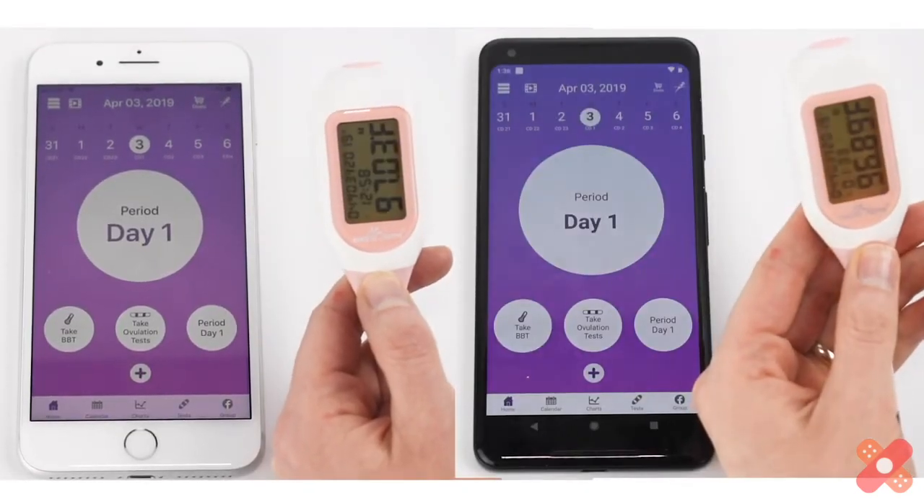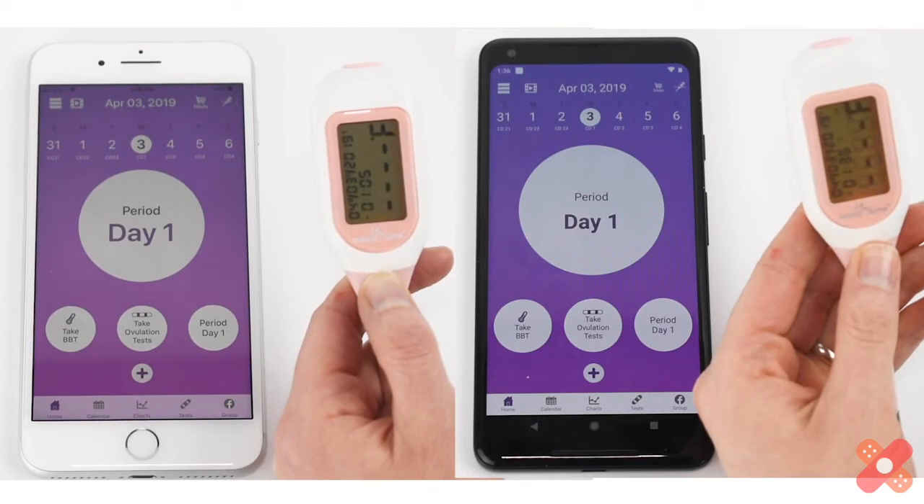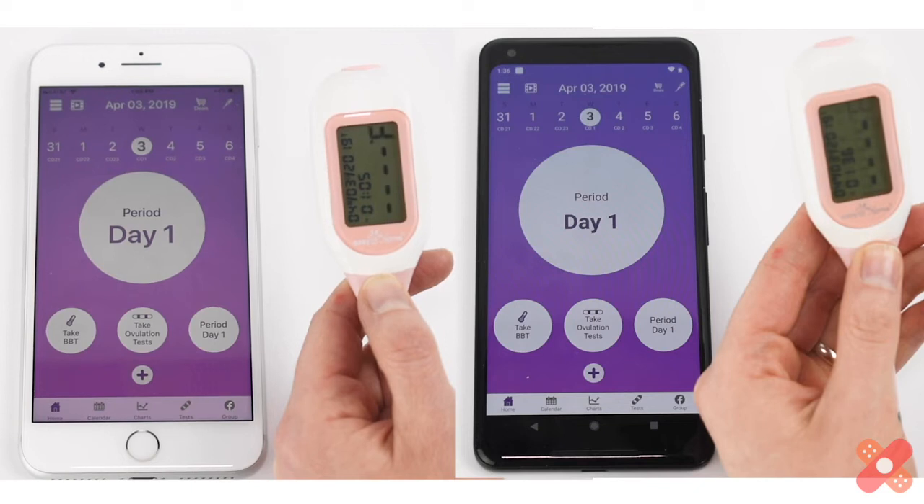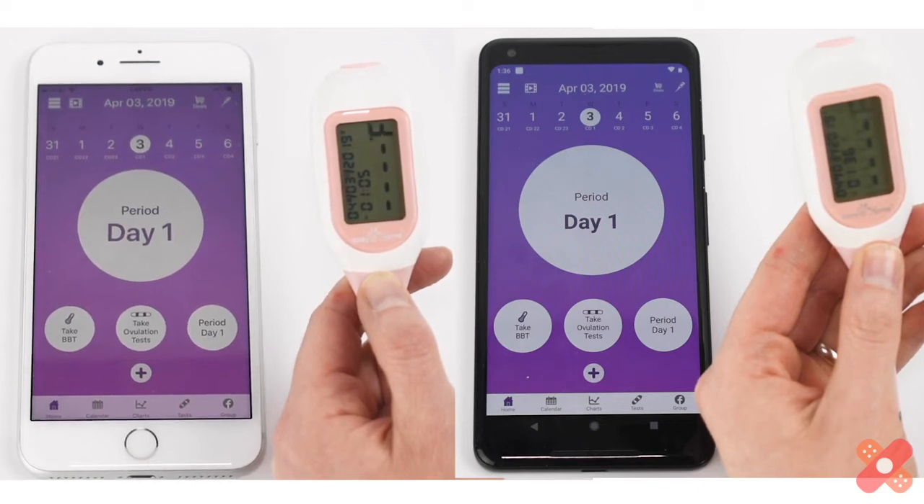Wait 90 to 120 seconds for your temp reading until you hear the double beep. If the app is nearby and running, the temp will sync to your phone right away. Otherwise, the temp or temps will automatically sync to your phone the next time your thermometer is turned on and near your phone with the app running and Bluetooth on.